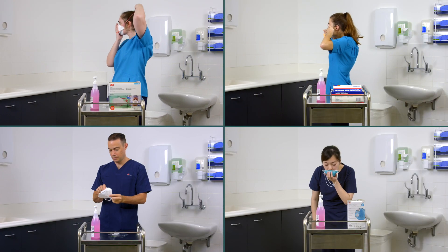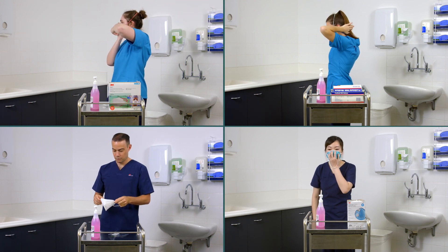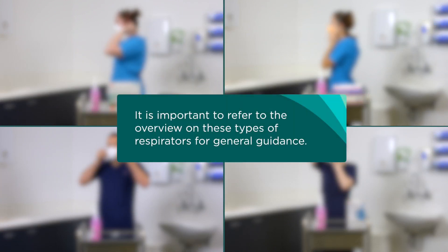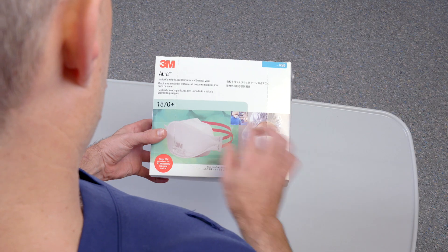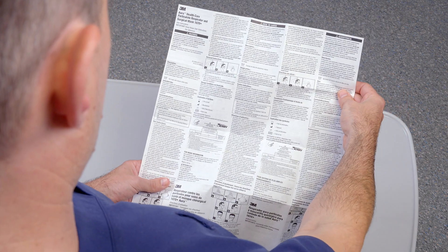This video forms part of a series on donning and fit checking P2 or N95 respirators in New South Wales healthcare settings. It is important to refer to the overview on these types of respirators for general guidance. This video does not replace the need to check the manufacturer's instructions for use.